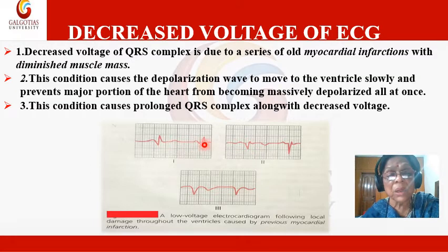Here we can see the voltage is decreased, and this is the result when the cardiac tissue is already diseased, maybe because of repeated heart attacks or some other cardiac disease.